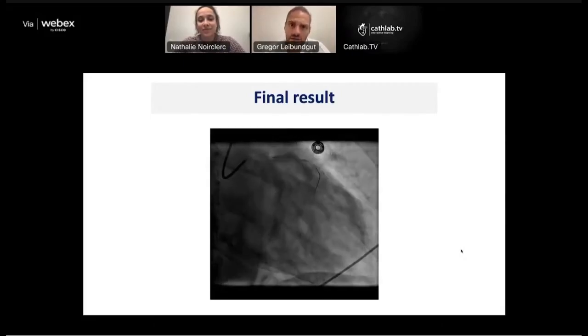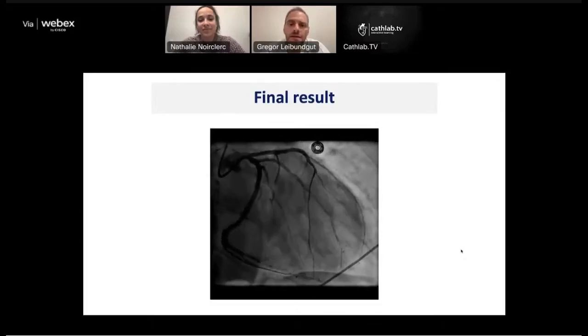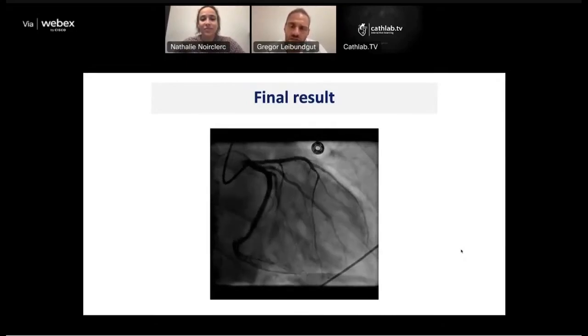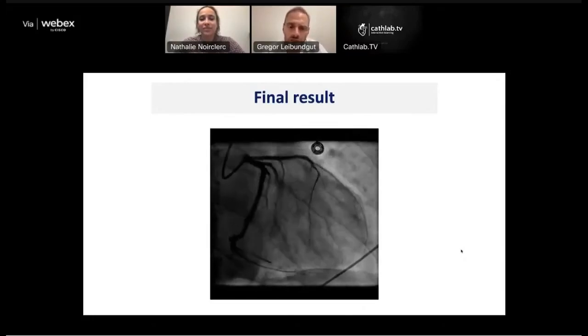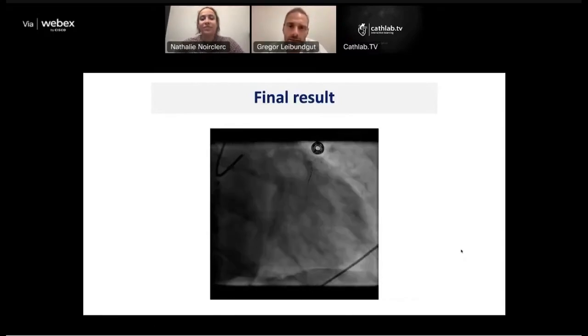There's two papers about underexpanded stents and shockwave. One is early, in freshly implanted stents. It works not as good or as efficient as plain IVL, because we believe that the cage of the stent absorbs a lot of the acoustic energy, and you have less energy beyond the stent, so it works less than pre-stenting.